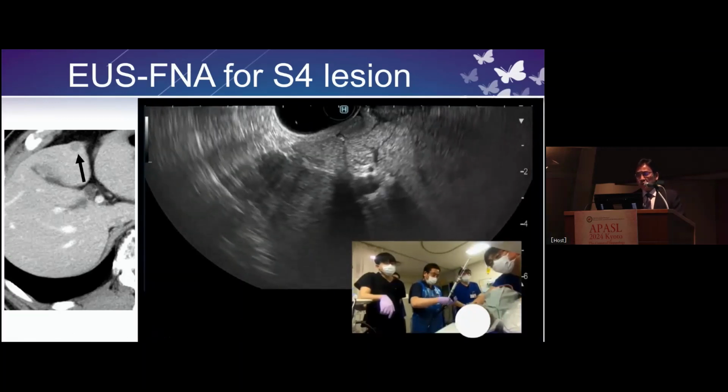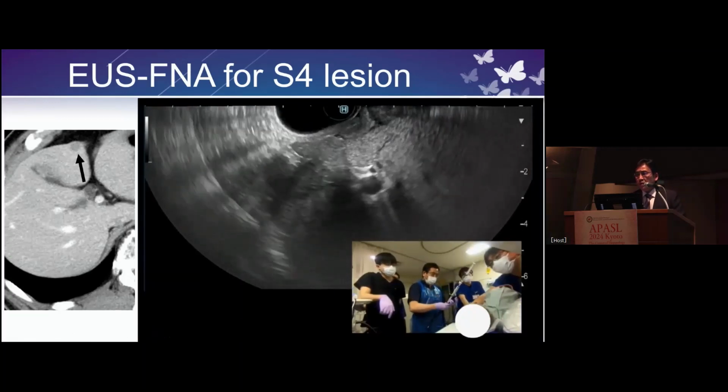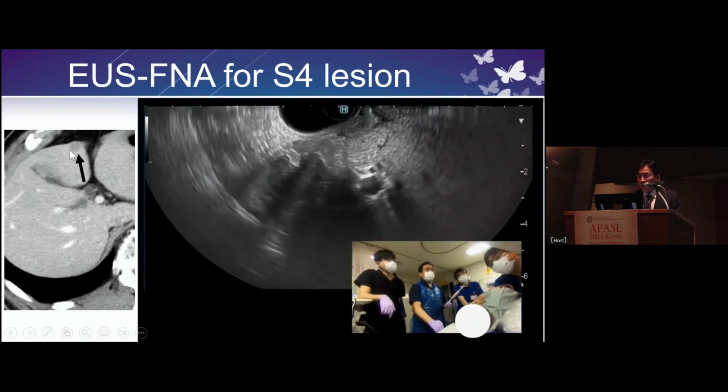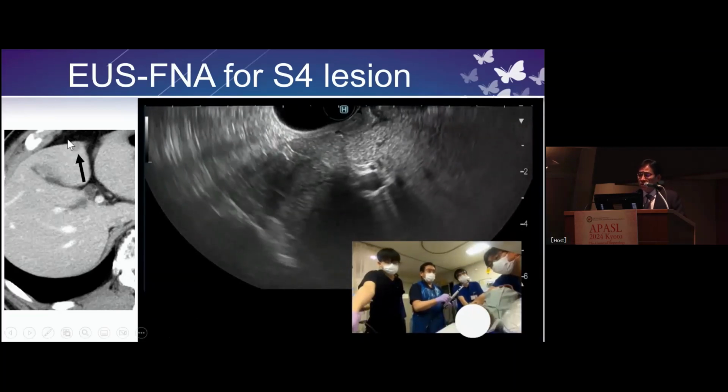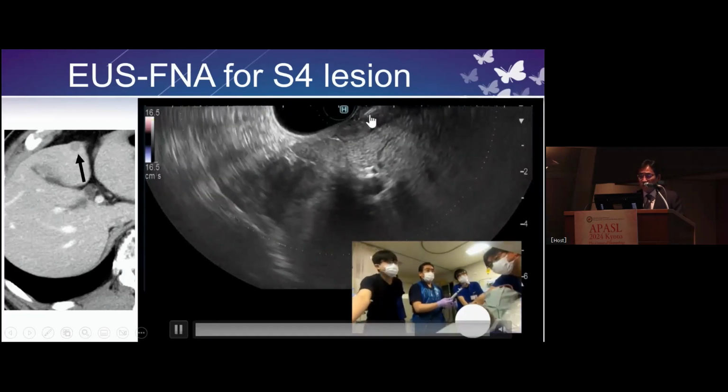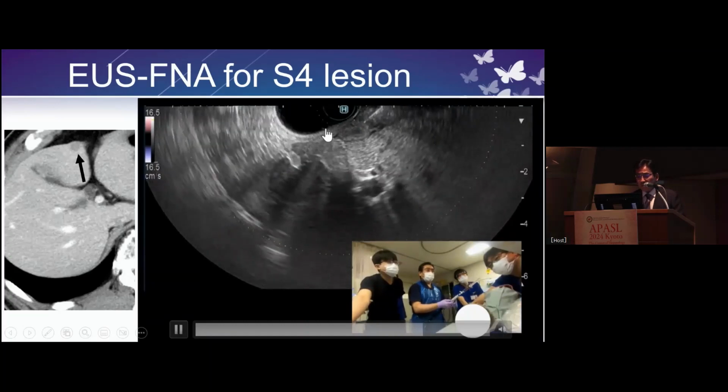This technique is most important. Sometimes segment 4 is very difficult to puncture, especially like this, a very peripheral region. This is a needle, and I puncture this region.